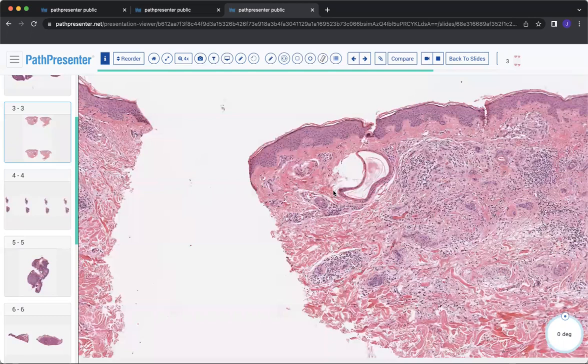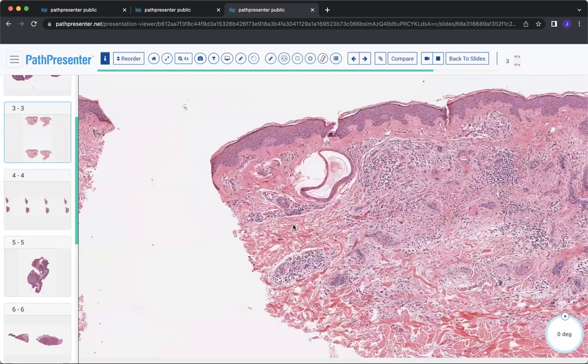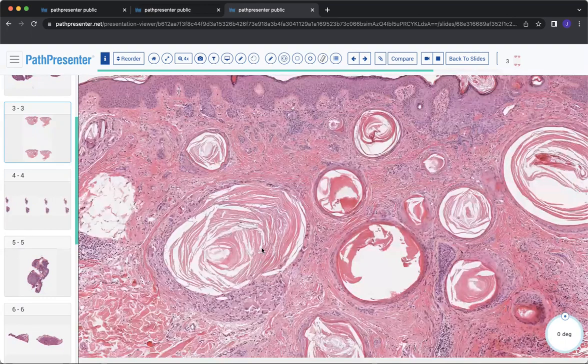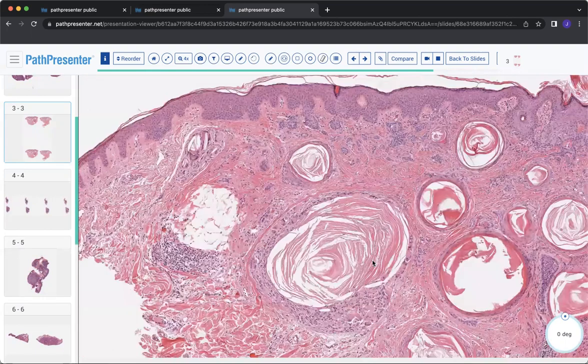I would encourage you to find many examples of a trichoadenoma so that way you can see the different shapes and sizes that they come in, the different flavors that they come in, so that way you'll be prepared to be entertaining it on your differential diagnosis if they give you a digital slide of a trichoadenoma.